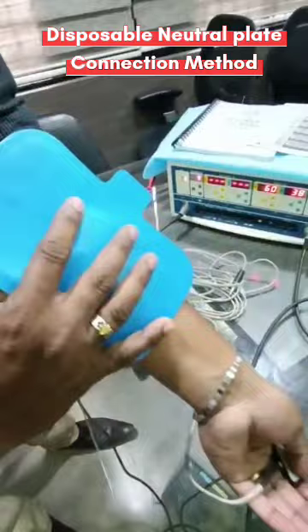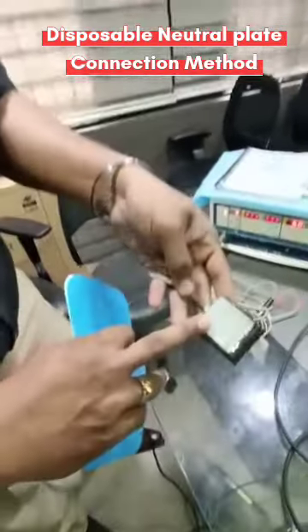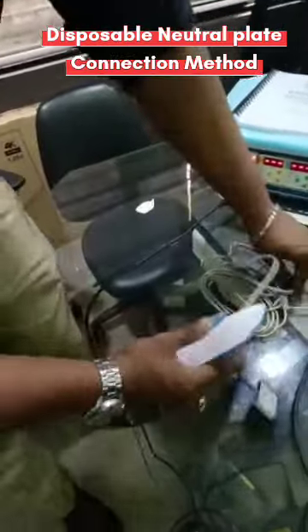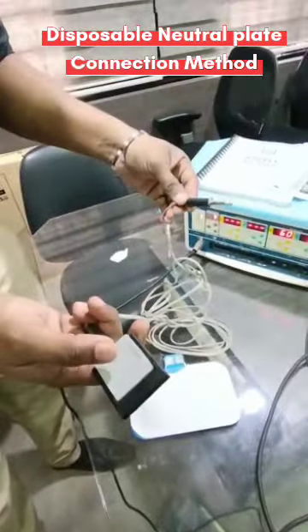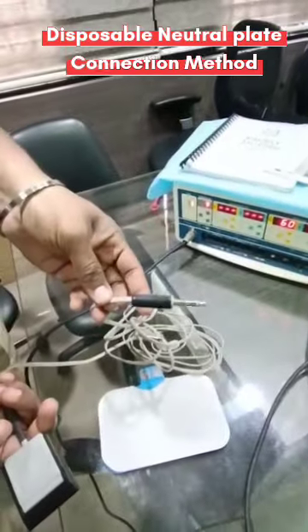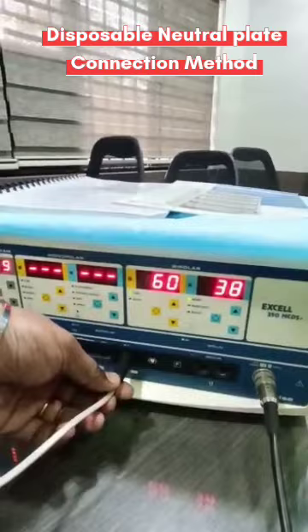You have to remove this paper and paste it over the patient. Before that, open this clip — this is the cable. See that it has two ends: one is the plate-connecting end, and the other is the machine-connecting end.